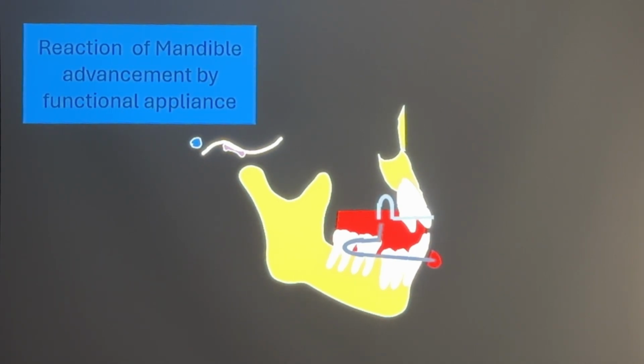For example, in the lower first molar, the cusp tip has 4, so you have already marked 4 marks. Please cut the indentation area.